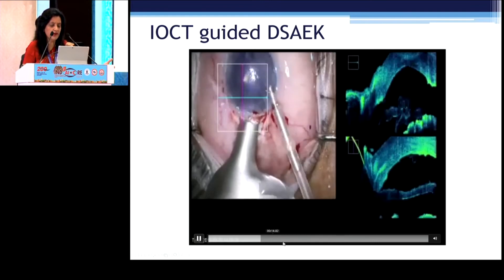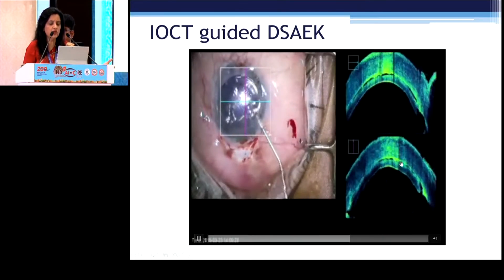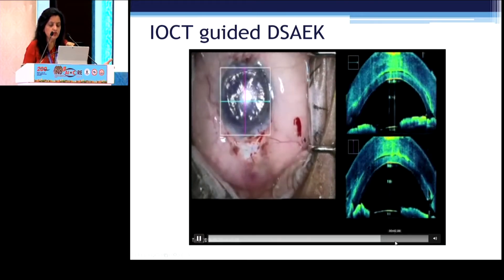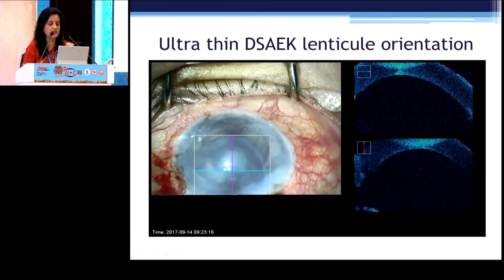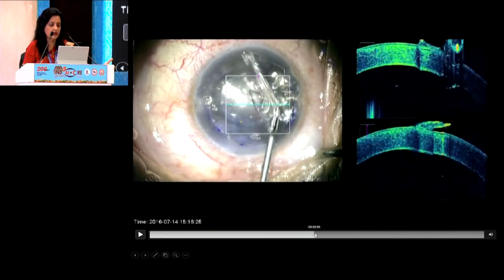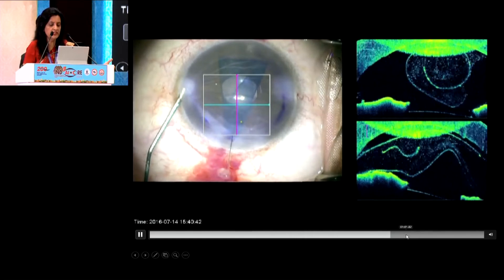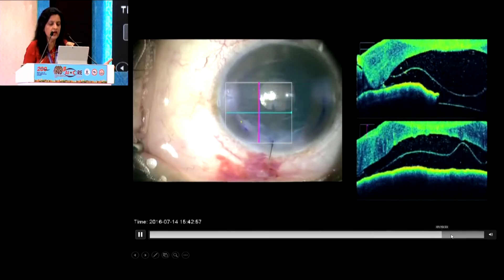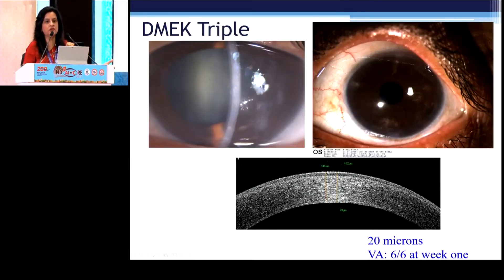For your DSAEK surgeries, when you put a graft especially in cases of hazy corneas, you can see the posterior lamellar lenticule. You put the air bubble and again you think you are done, but look at these gaps which are there, and look at this gap that comes up when you hydrate the wound. You know it is not completely done and you have to go and address that again. But if you didn't have this intra-op OCT microscope, you would have to do the same procedure maybe the next day. This also clearly shows the orientation of your DMEK graft — when you are putting it inside the anterior chamber, you can see an upside-down orientation, so you flip it and put it in the correct orientation. When you see it is pretty much attached, you get an excellent post-op result.